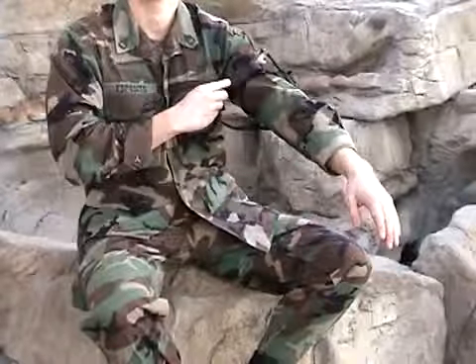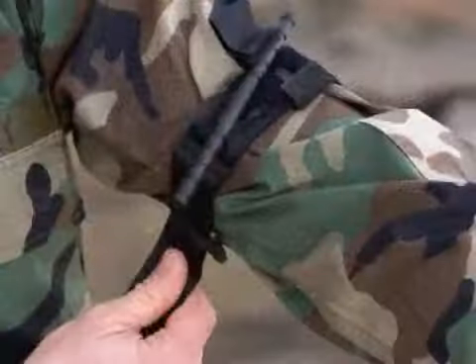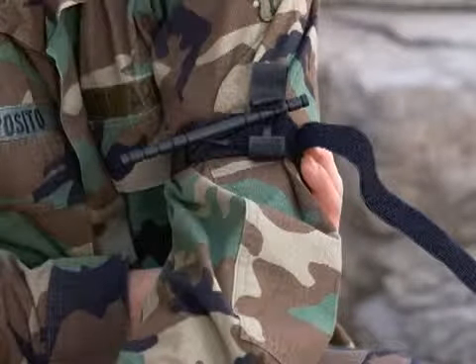Place the wounded extremity through the loop of the self adhering band. Pull the free running end of the self adhering band tight and fasten it back on itself. Do not adhere the band past the windlass clip.